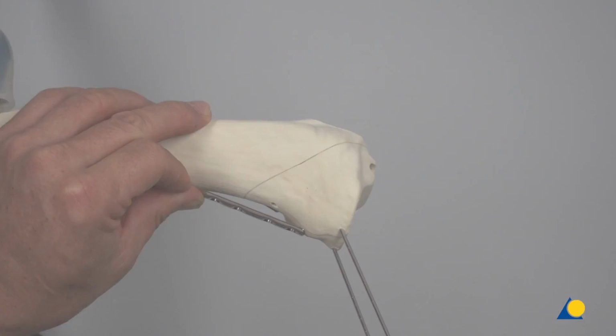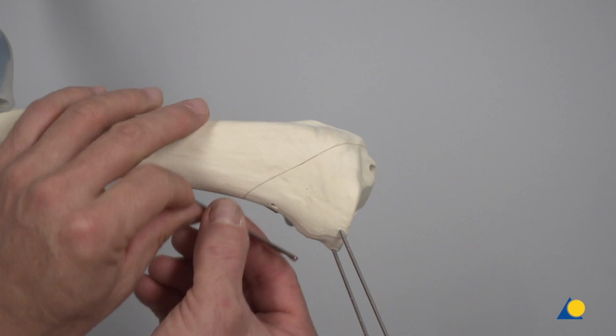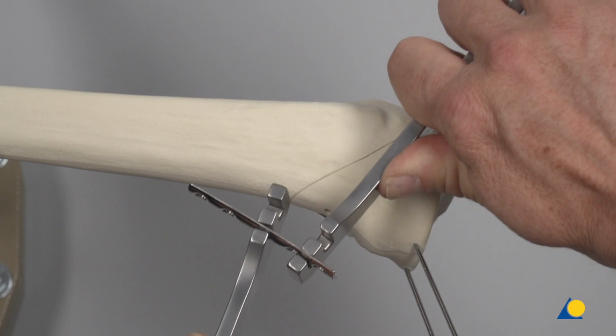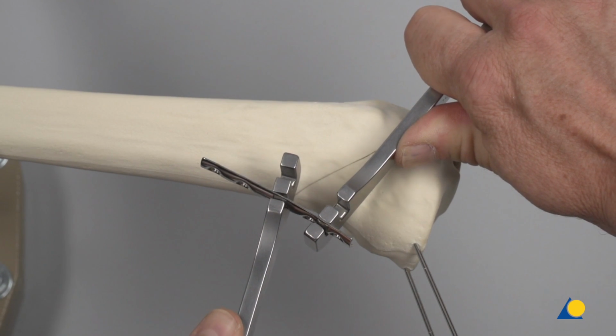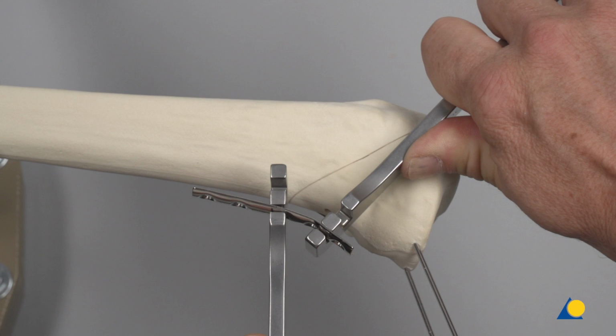A 5-hole, 1/3 tubular plate is positioned at the apex of the medial fracture line. The bending irons are placed onto the plate and the plate is underbent to slightly less than the contour of the bone. Observe that slightly underbending the plate helps achieve the optimum buttressing effect.